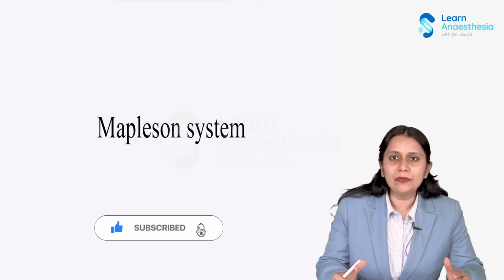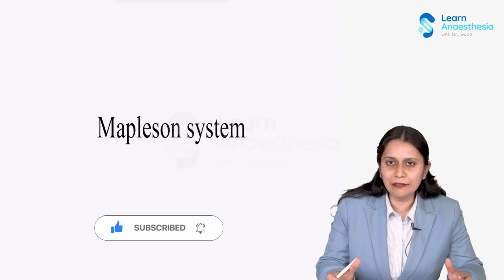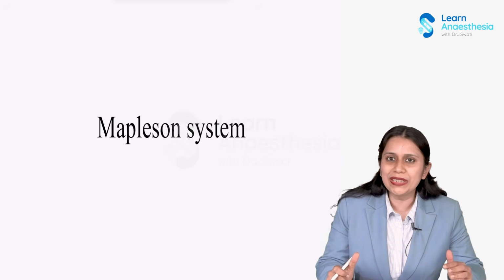Now, Mapleson system, which constitutes 6 circuits, A, B, C, D, E, F. It is a system which is classified by Mapleson, but not any of these circuits were designed by Mapleson. He did a functional analysis of these circuits and classified them under one system, that is Mapleson system.